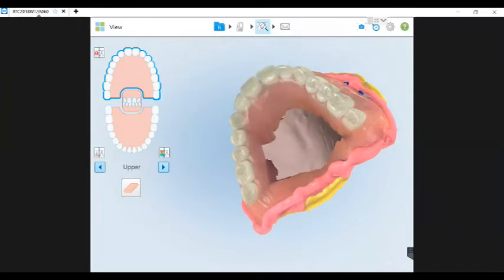So the depth of the patient's palate is really going to make a difference. As all of you that have iTero scanners know, the wand itself must be touching the surfaces that you're scanning. So if the patient has a very high vault of their palate, it's going to be challenging to capture that, whether it be intraorally or scanning the denture itself.